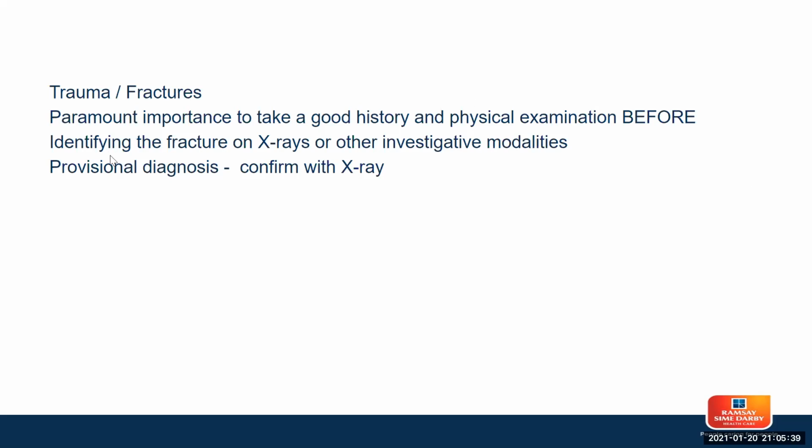All right. Of course, there are other investigative modalities that are available now. You have CT scans, MRIs, and various other imaging that can be done. But there are certain centers in Malaysia which do not have that facility. If you're in a rural hospital and whatnot, you may only be stuck with an X-ray. So you may need to learn how to read it properly and to interpret whatever you read properly. So the X-ray is generally used to give you a provisional diagnosis, and the provisional diagnosis is given by your physical examination and your history, and the X-ray actually confirms what you think it is.